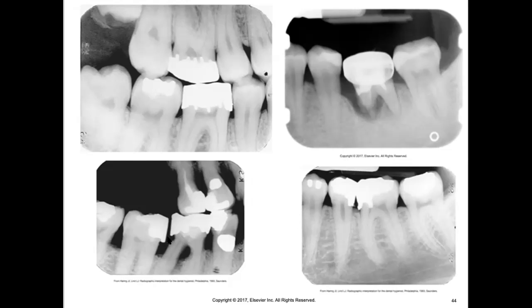Okay, down here is the same thing. We have a perfect floss cutter here. Very, very poor restorations. There is literally no adaptation from the restoration to the tooth. It's very poorly done. Lots of bacteria can get through here, and it's just kind of exacerbating this bone loss. We see some very severe furcation involvement here. Lots of bacteria is getting underneath this furcation, where definitely not the patient and really not even the dental hygienist can get instruments underneath there to effectively clean that out.